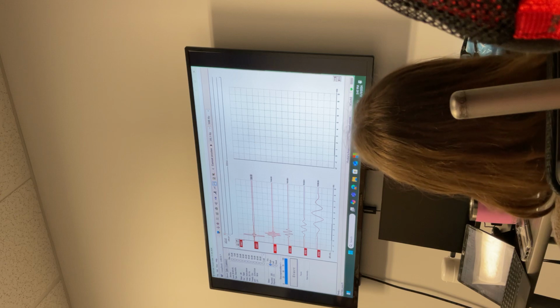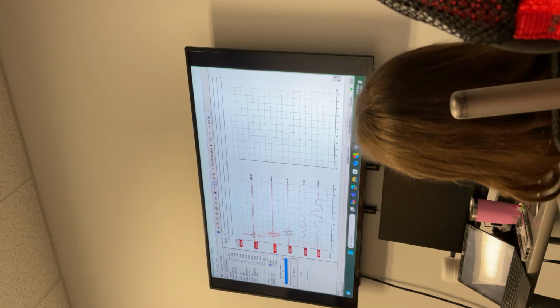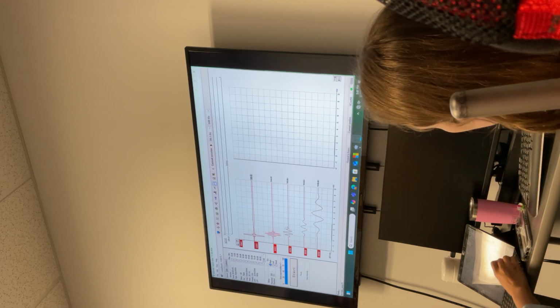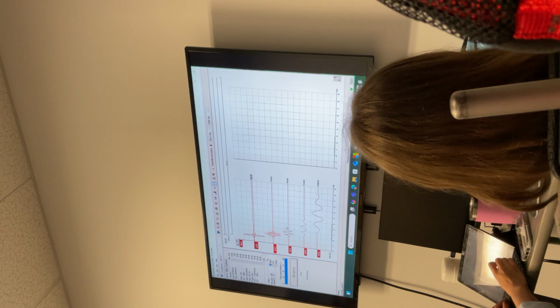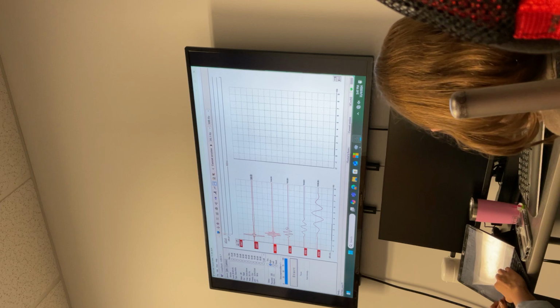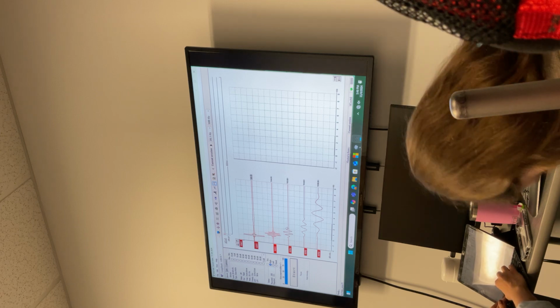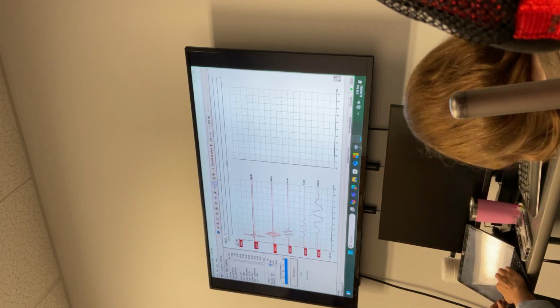So this was all clicks and tone bursts. Click and tone burst make one combination. Click is broadband, tone burst you get frequency specific. The counterpart to that is your chirp, broadband chirp and narrowband chirp. Broadband chirp is the counterpart of click. Narrowband chirp is like a 500 Hertz tone burst, you've got a 500 Hertz narrowband chirp, 1000, all that. Okay, so I'm going to save and start a new page.